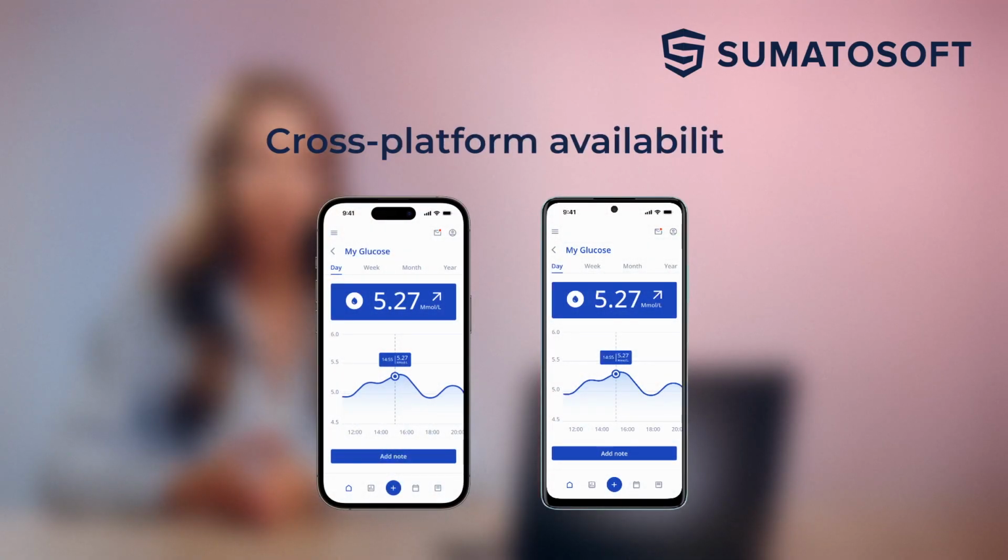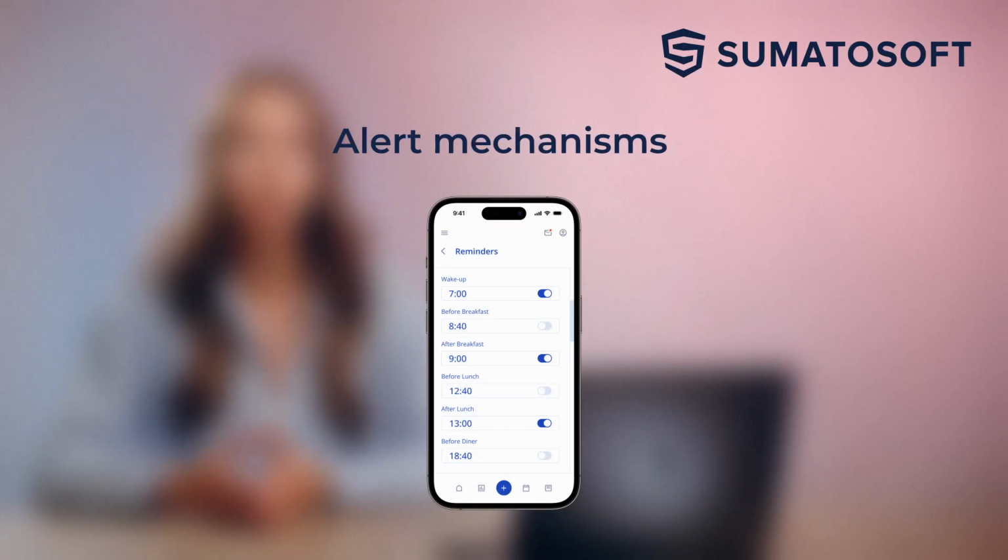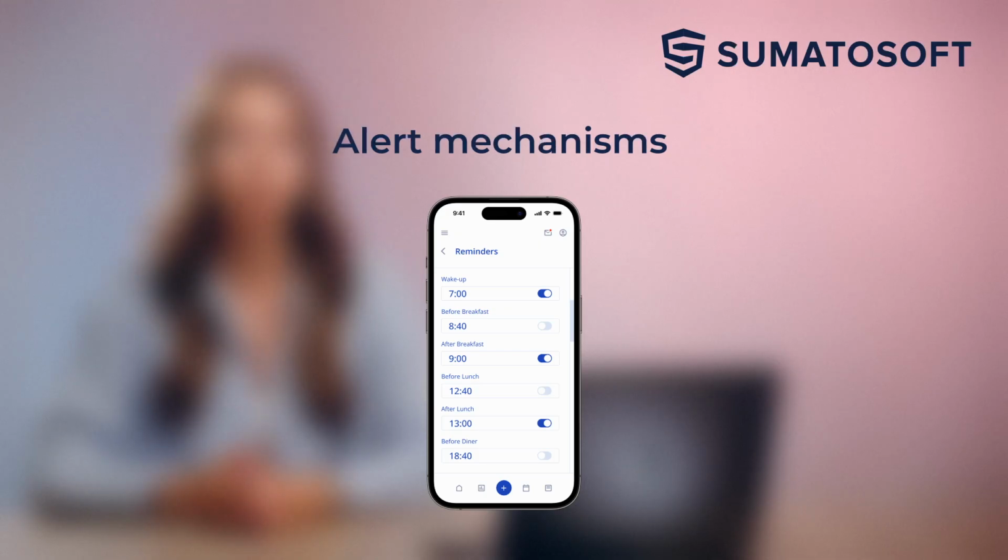Cross-platform availability. The app works on both Android and iOS devices, so more people can use it regardless of their phone type. Alert mechanisms. We set up automatic notifications that alert users when their blood sugar levels are too high or too low. This feature helps users take timely action like administering insulin to manage their health better.